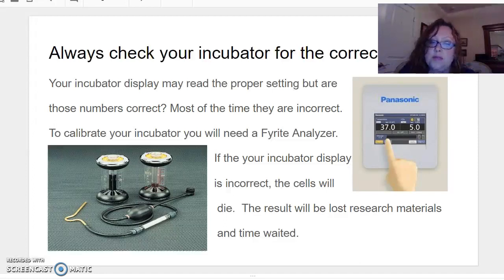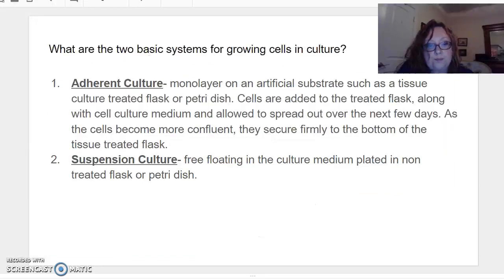This is so important because when you're trying to troubleshoot your research, you ask, well, what happened? Did we euthanize the animal too soon? Did we use too much collagenase? Or did we not wash off the trypsin? What happened? So you're trying to troubleshoot. And I'm guilty of it myself: if you don't pay attention to this, this is where it ends and begins. If it's not healthy, then you will have disaster with your research.